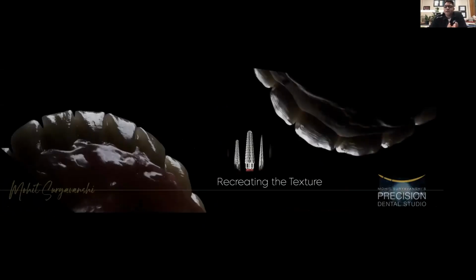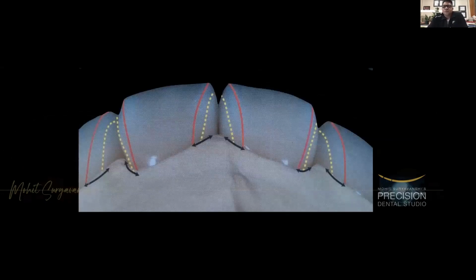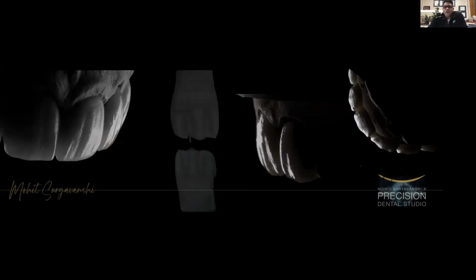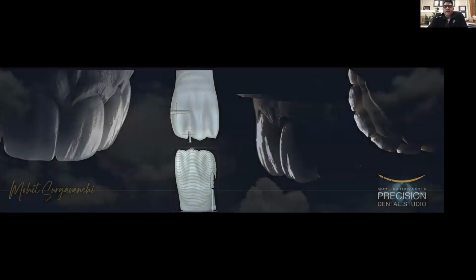Whichever material you are using, you need to achieve the right kind of texture. You might be using high performance polymers, resins, ceramics, or zirconia, but the tooth should look like a tooth. Material choice should not be an excuse. We should be able to exactly mimic what a natural tooth replicates in the restorations that we are making, may it be an implant supported tooth or a regular tooth. So texture is also very important. We can also study it in the wax form.